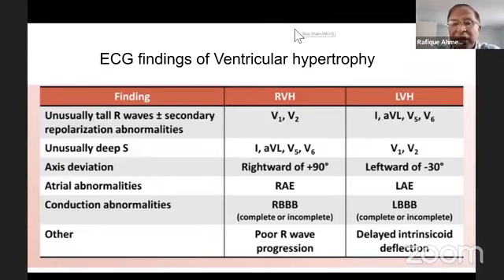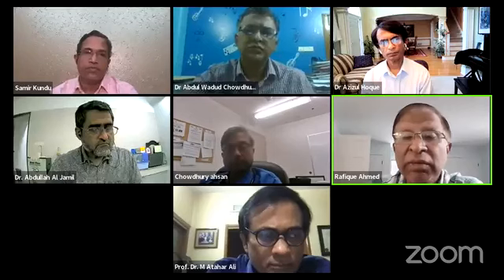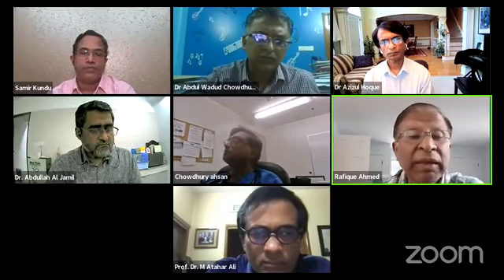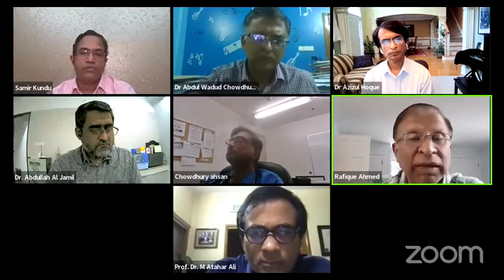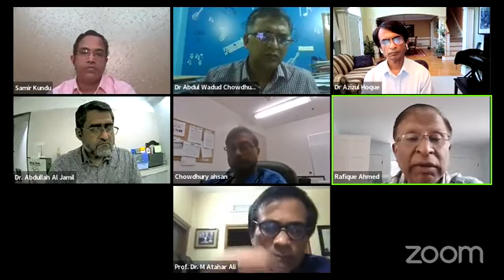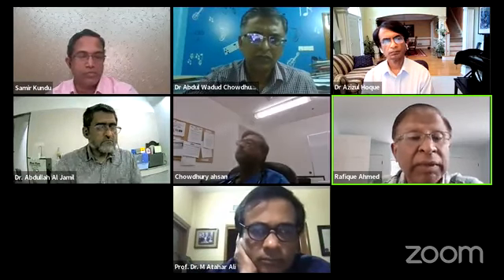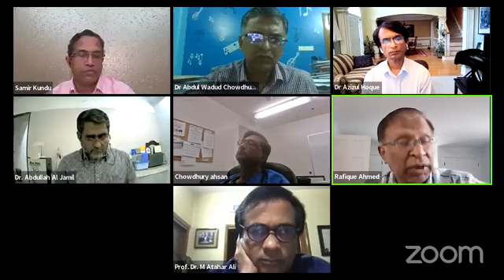Wadud mentioned something, that if you are in an Upazila health complex and you think somebody has LVH, you can make an assumption, maybe there is cardiac dysfunction. I mean, this is the good old clinical medicine that our professors used to practice. They didn't have anything at all, no investigation, nothing. But we at least have the EKG available.